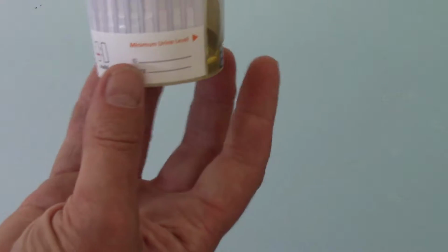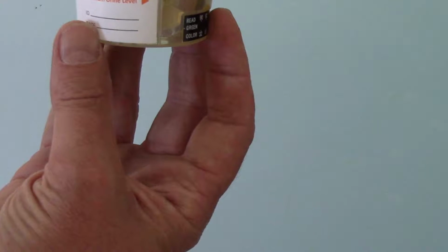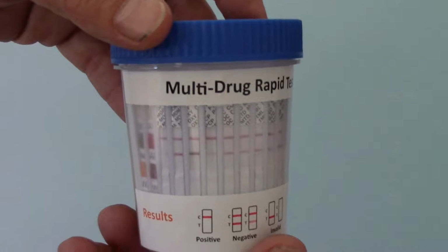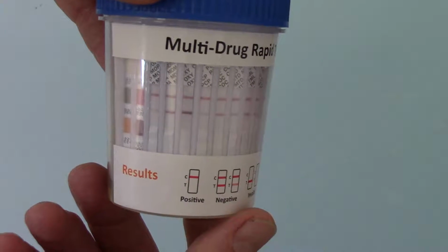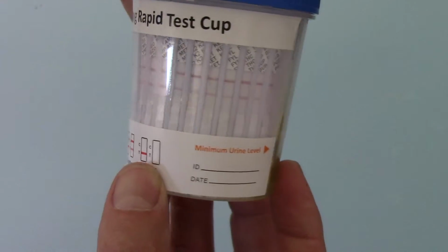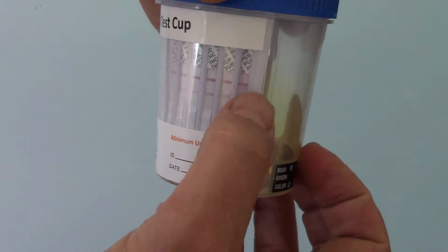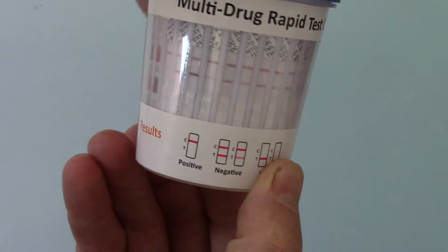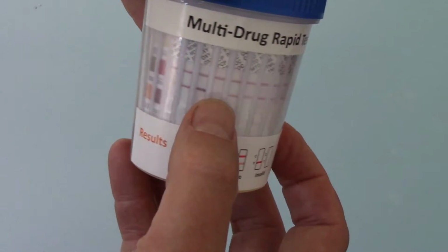And then this urine test has now just been running for approximately 2 minutes. But you can see, if I bring that into focus on the camera, what we've got already showing along the top there is a full set of control lines all the way along, with underneath it a set of developing test lines.